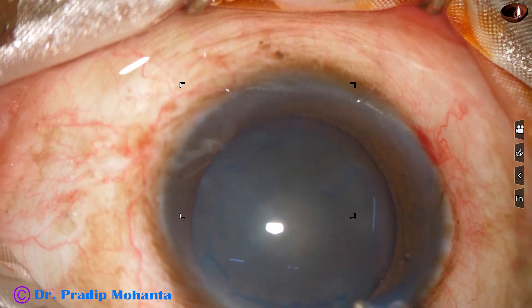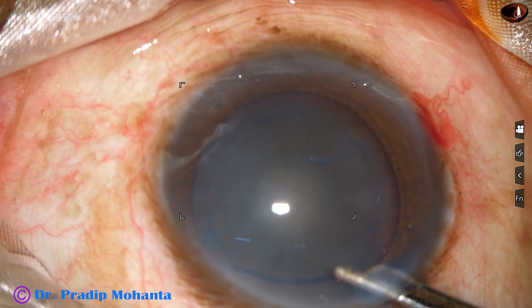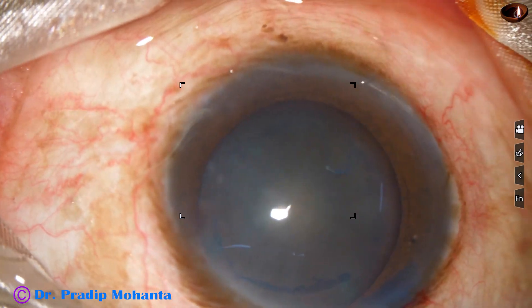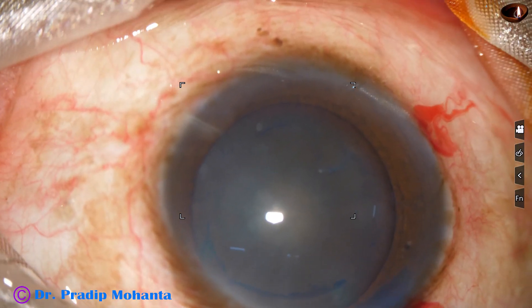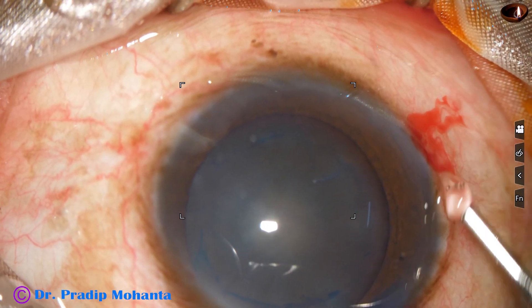And now the anterior chamber is filled up with viscoelastic substance. In this case we are going to use 2% hydroxypropyl methyl cellulose. Here it goes.